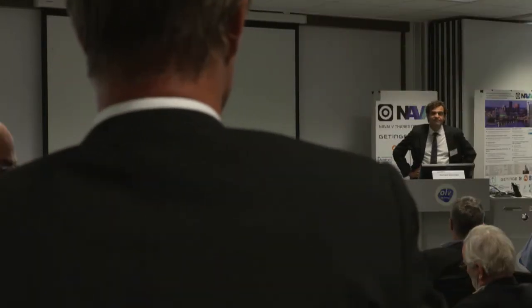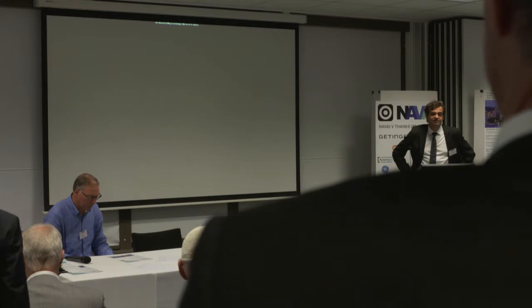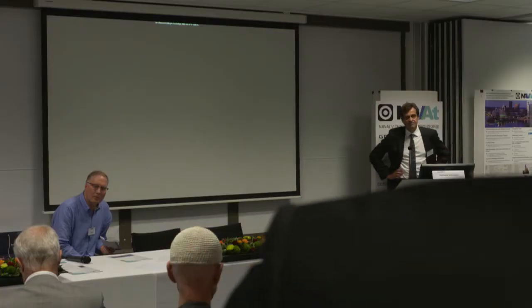Thank you for an excellent presentation, Gerhard. My question is, in your combined model, where you have EEG and drug concentrations, do you have a function which distinguishes if your inputs are giving different indications? Your EEG could indicate that the patient is awake, while your propofol concentration might indicate that the patient is deeply asleep. That should give you some possibility in terms of alarm mechanisms, or I don't know if that's something you have included in your model.